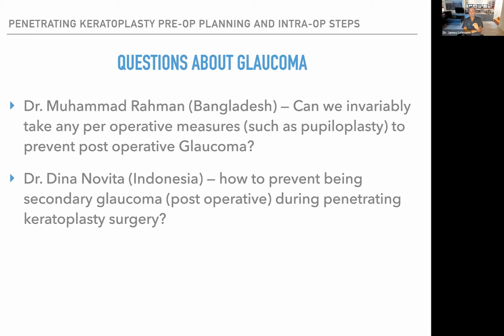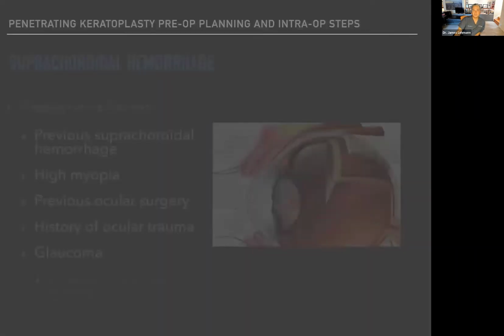Dr. Novita from Indonesia asked how to prevent secondary glaucoma during penetrating keratoplasty. Like I said, you size it right, you're gentle, but still it can happen. So if it happens, that's why you have to see patients even if they're not having problems, because you have to be able to measure the pressure, etc. Now, management of glaucoma after transplant is more in my postoperative talk, so we'll skip that.